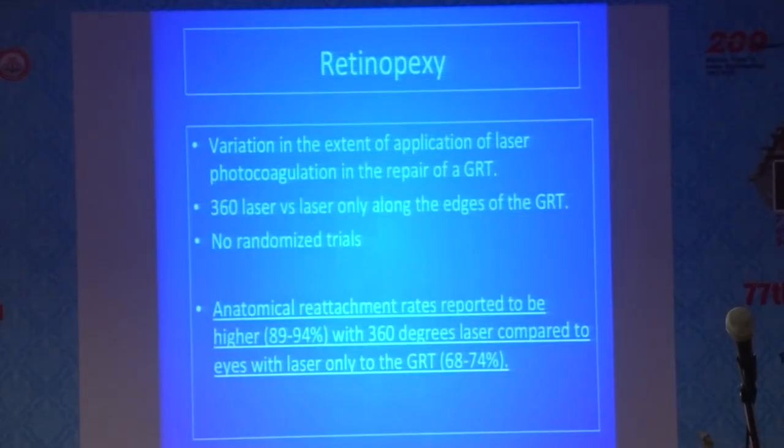And then the retinopexy. Another question is whether you'll do a 360-degree laser or you'll just laser the giant tear. So there is wide variation in the extent of application of laser. There are no randomized trials, but the anatomic reattachment rates are reported to be higher with a 360-degree laser compared to eyes with laser alone to the giant tear.